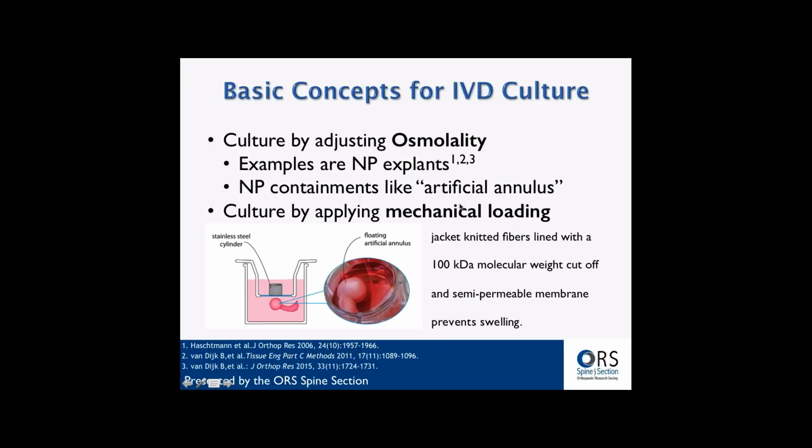I just wanted to point out again what Christine Lemaitre also mentioned, that adjusting the osmolality is a nice way to diurnally load the disc when you do not have a mechanical system. Osmolality will also reproduce this daily shrinkage and expansion of the disc.